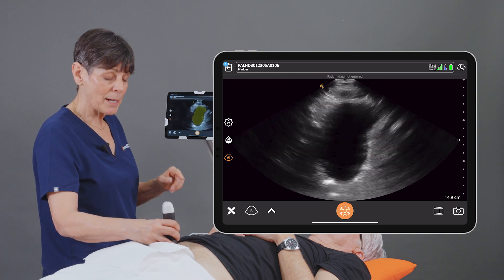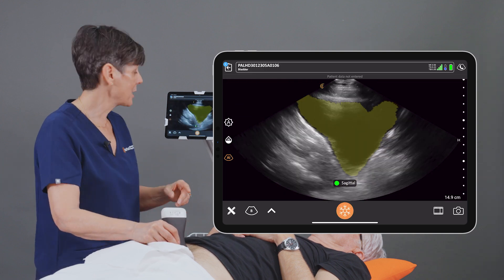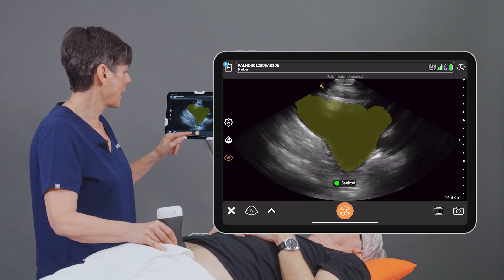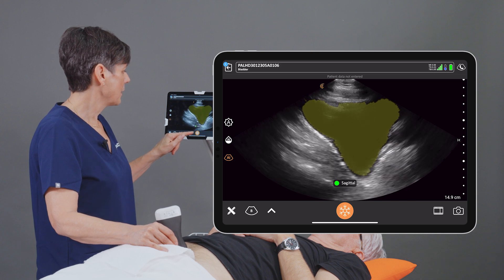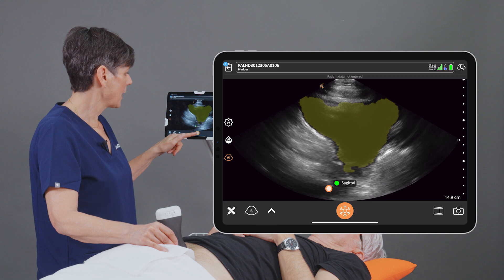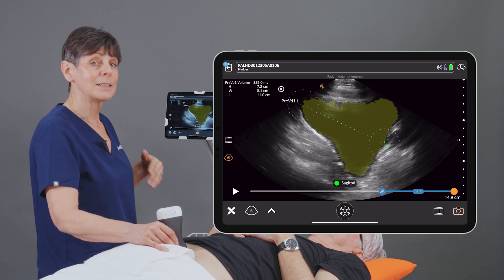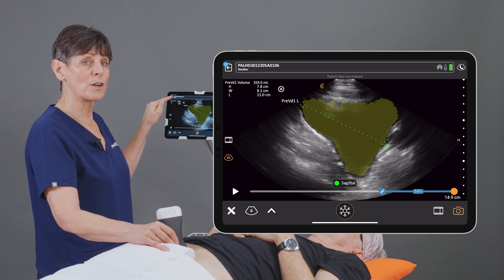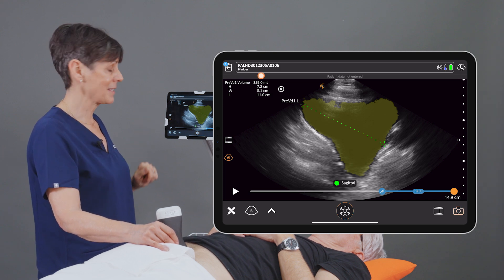I'm going to unfreeze my image and rotate the scanner 90 degrees. We're going to get a sagittal image of the bladder. Again, the AI is identifying this as sagittal. When I hit the Freeze button, it places the calipers, and at this point our volume is calculated in the upper left-hand side of the screen.